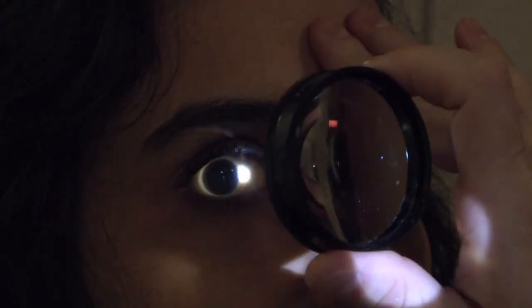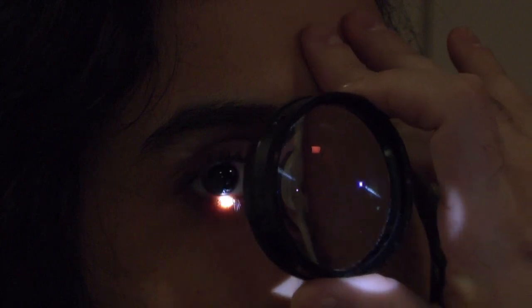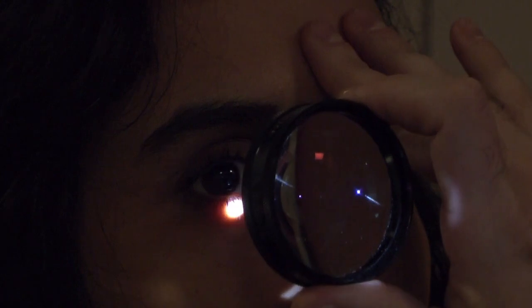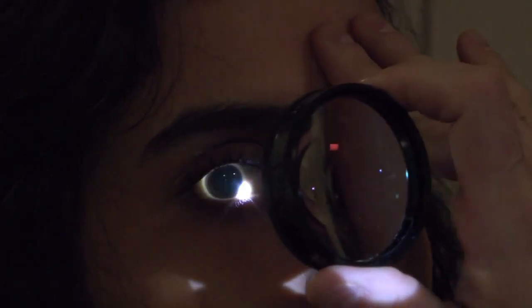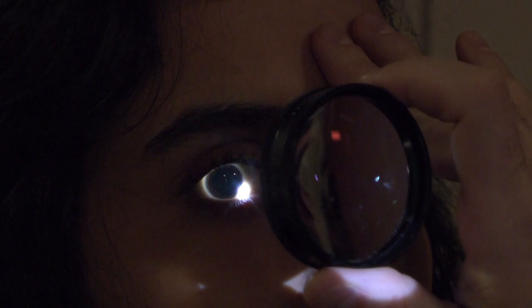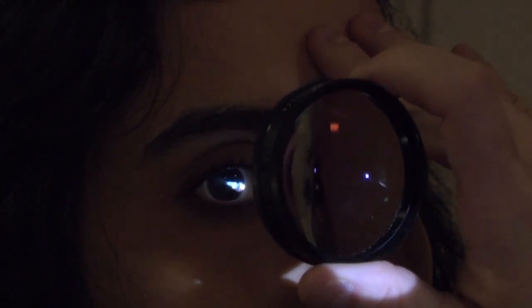Common mistakes include drifting of the lens and moving the head such that the light is displaced onto the cheek or forehead. Some ways to troubleshoot if you're not seeing a focused image include moving the lens towards and away from you. You can try very fine movements superiorly and inferiorly and left and right. If you're having problems with glare, try rotating the lens towards or away from you.